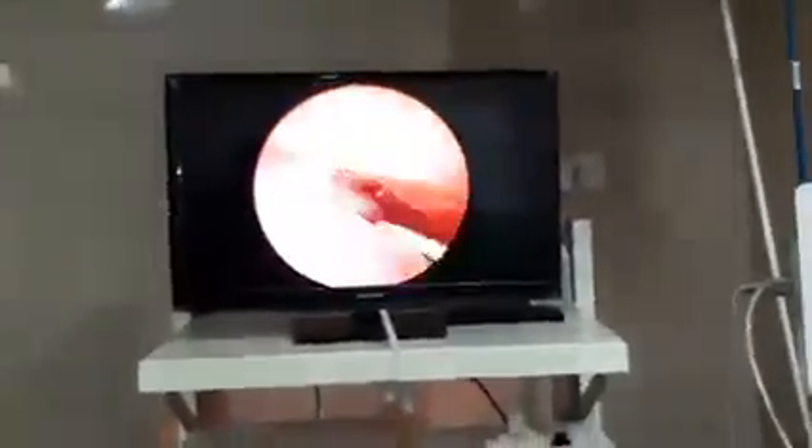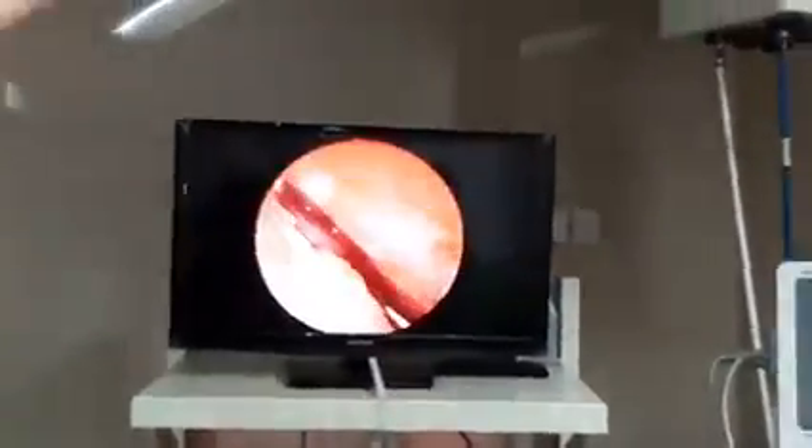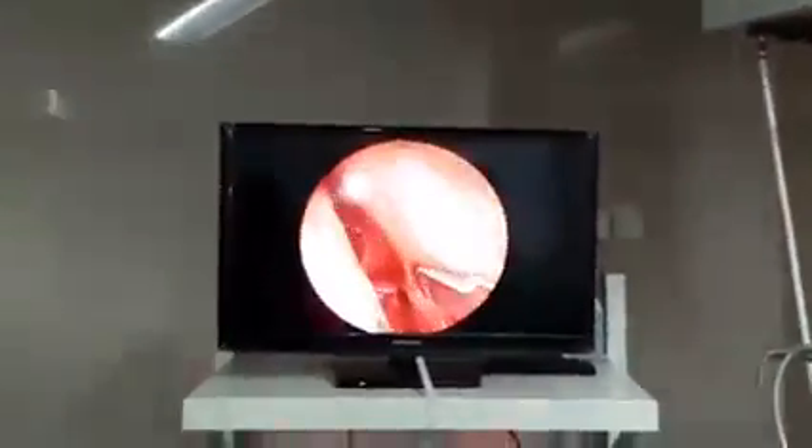This is the flap on the opposite side, because the bony part has been taken out. So this is done properly.